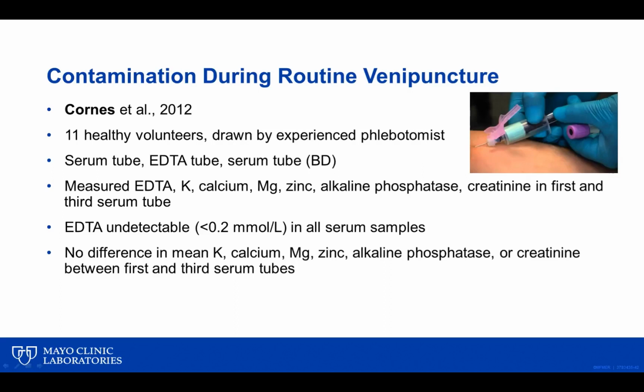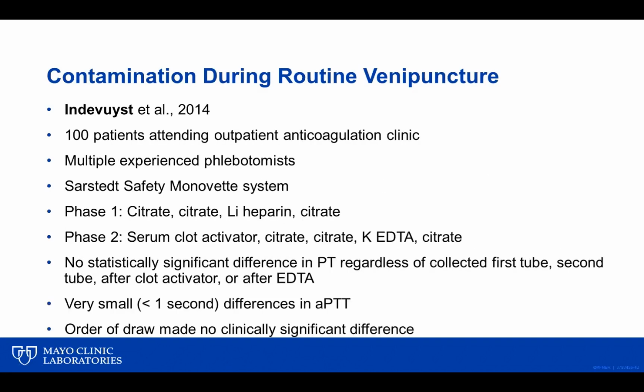So there's no difference between the serum tube before the EDTA and the serum tube drawn after. This was really a small study of 11 healthy volunteers, but it really didn't find that contamination occurred when you drew an EDTA tube before a serum tube.